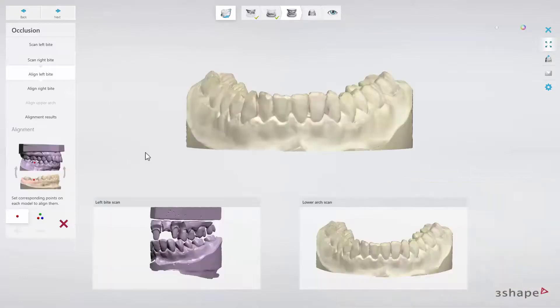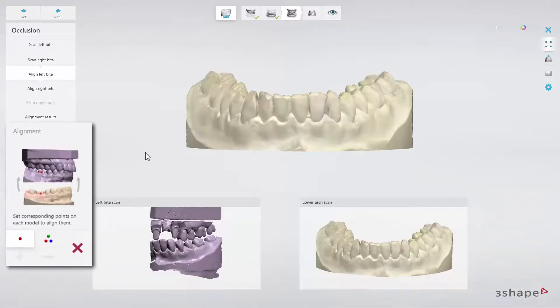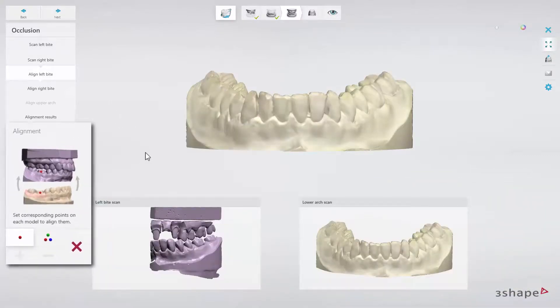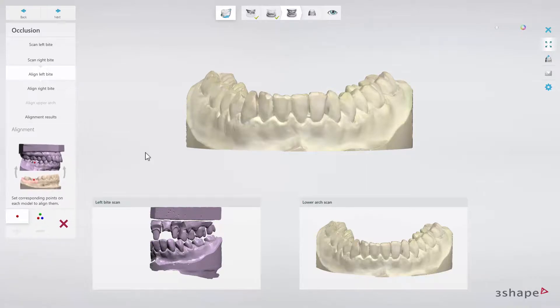You can now perform manual alignment. You may do it in two ways, using one or three-point alignment. First, you have to align the left bite with the lower model.